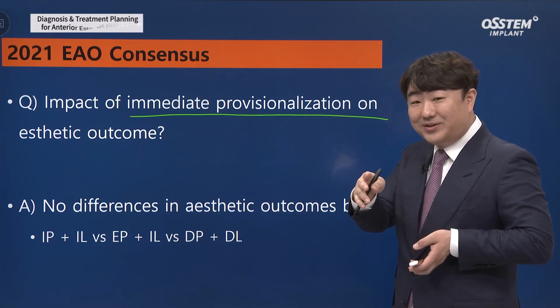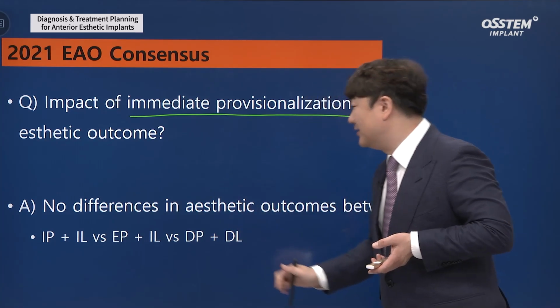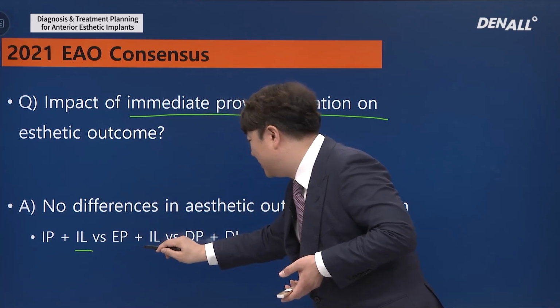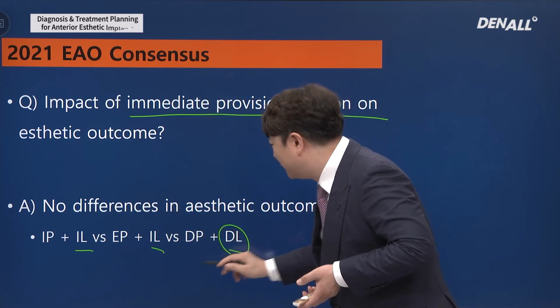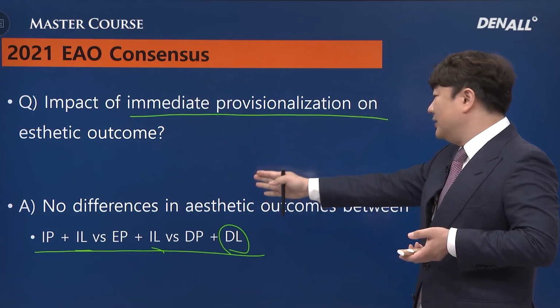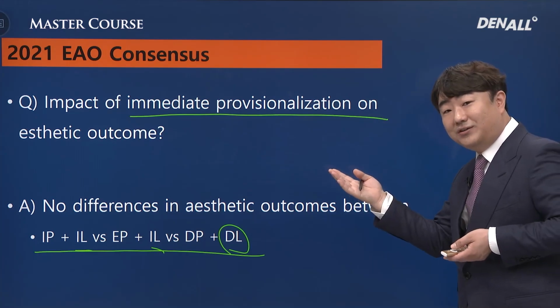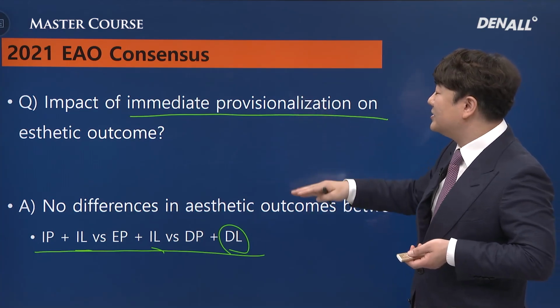Previously, people have said it does. Considering evidence level, in this study they just compared 3 instances of immediate loading and delayed loading. It says that there's no major difference. In terms of immediate or delayed loading, there were no major differences in aesthetic outcomes.